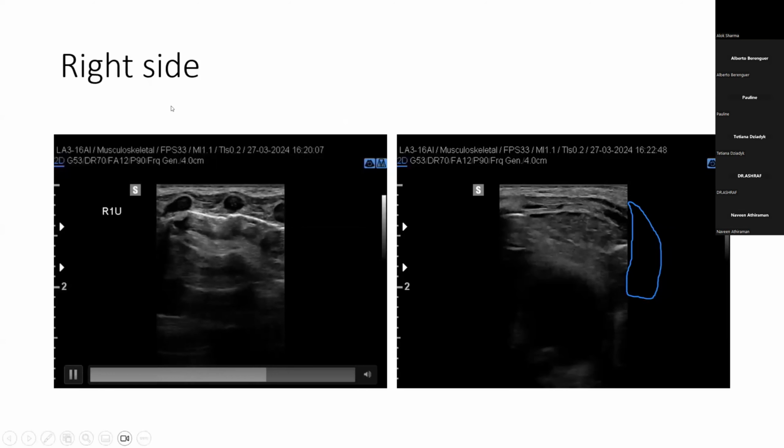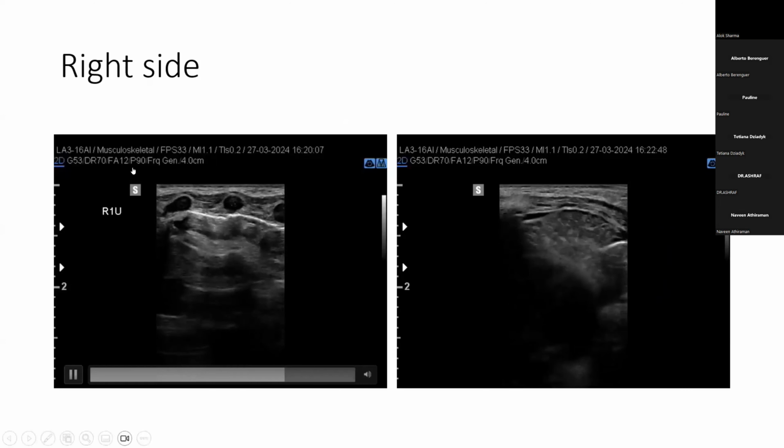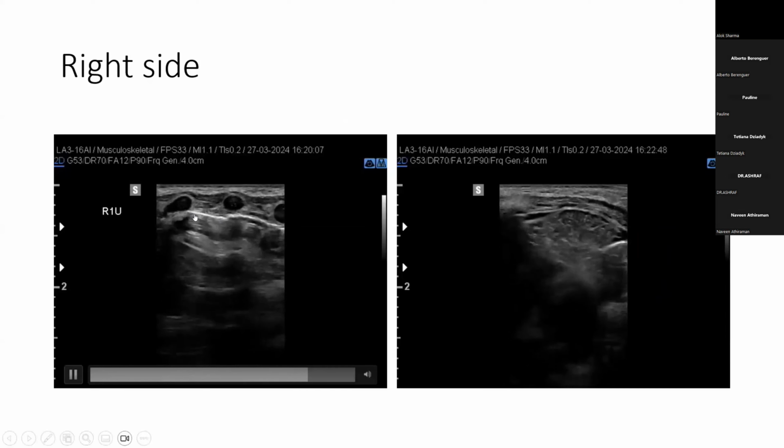So I did an imaging on the right upper side, so normally the good part, where in the beginning I see on the line of the nipple, so in the middle, mid clavicular, I looked, and there I saw, for me, an A-dash profile with no significant pleural sliding.